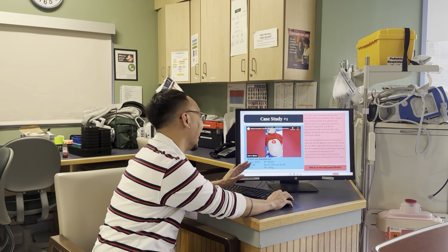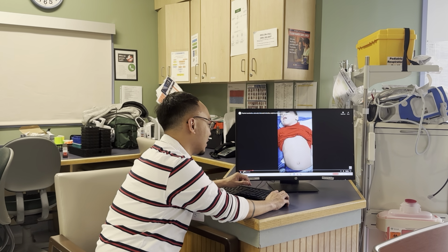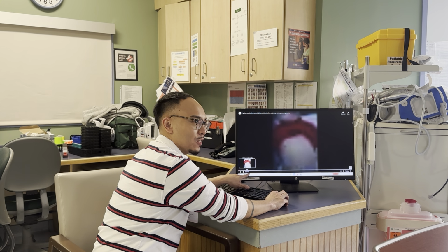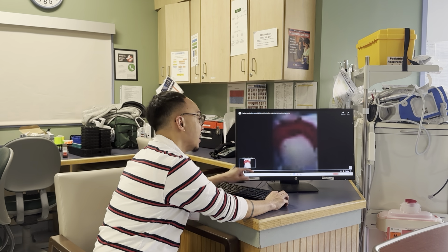I hope so. I know it's usually on the monitor, but this one's a little bit hazy. I'm going to give you some clues. This is 14, 15 seconds. So whatever you count, what are you going to multiply by? 4. Nicely done.